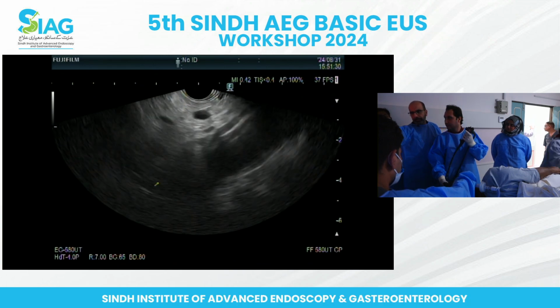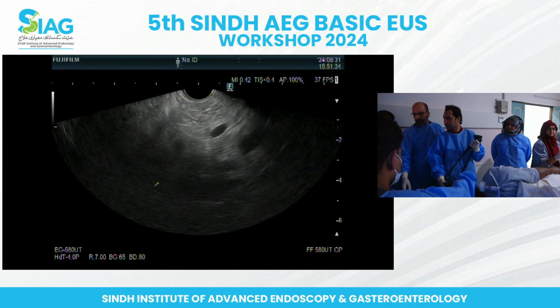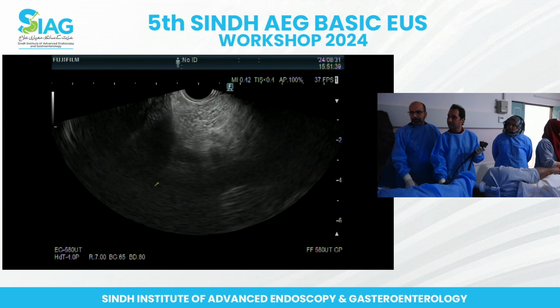Just push forward because you're losing it. So push forward. There you go. That's good. And go, yeah. See that brisk movement? I get it. You want me to keep it to the pancreas. The pancreas, exactly. Yeah. That's the idea.